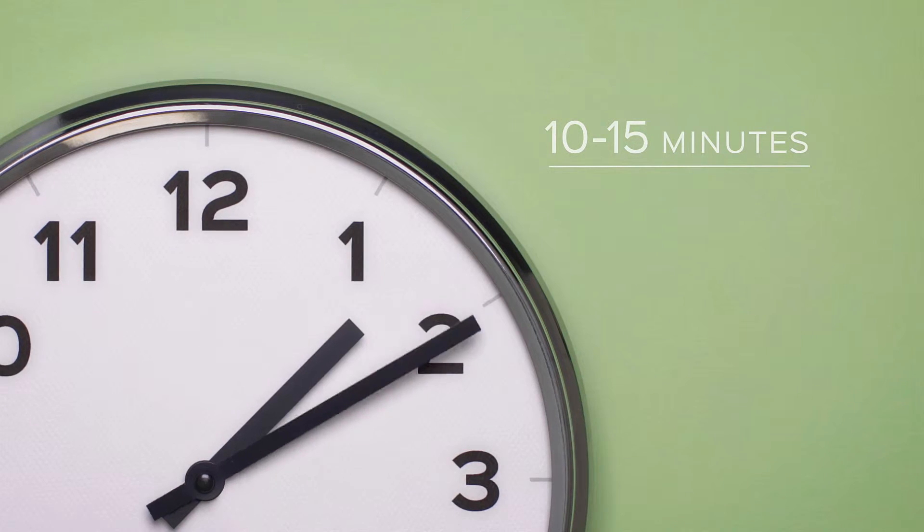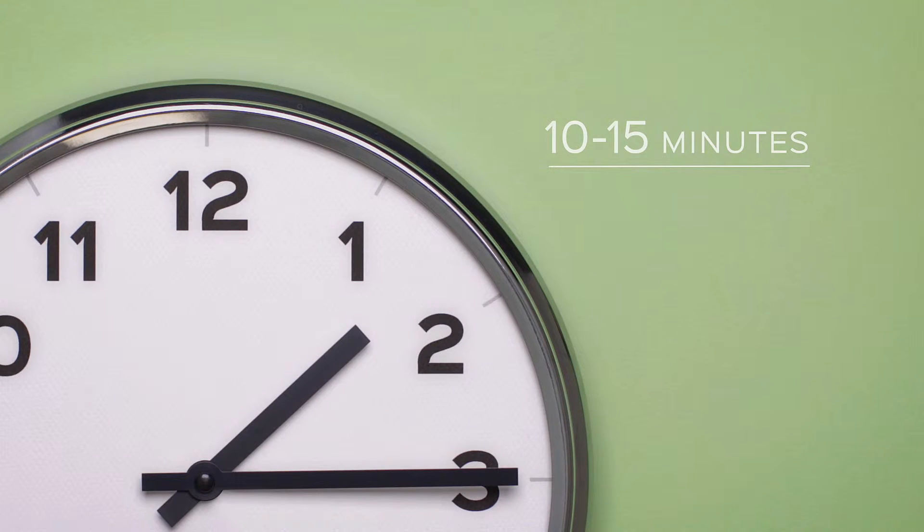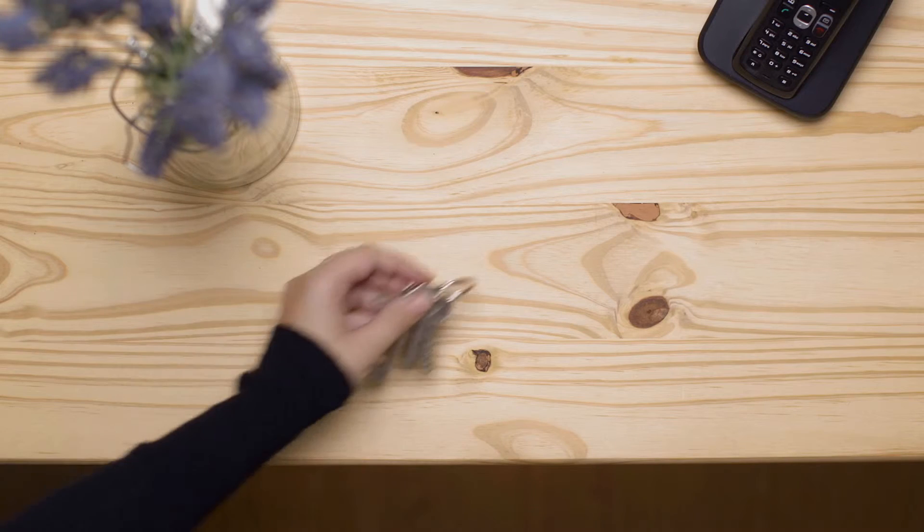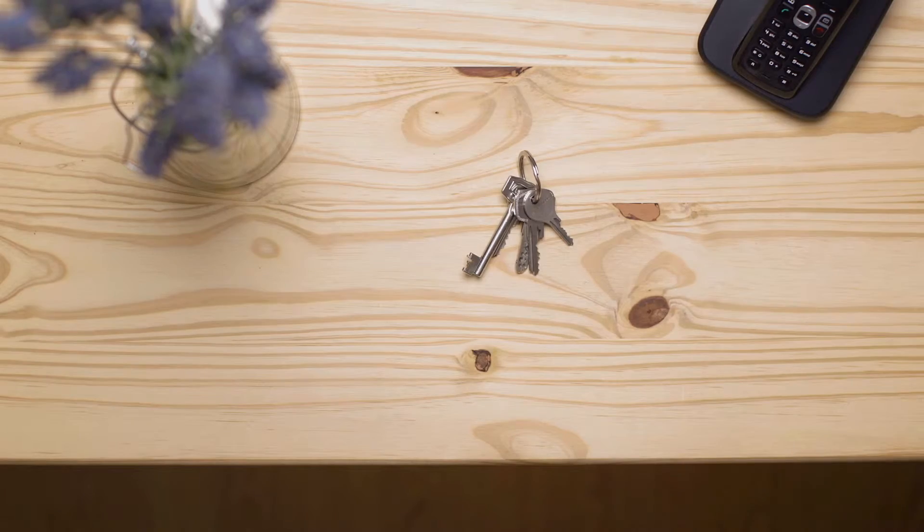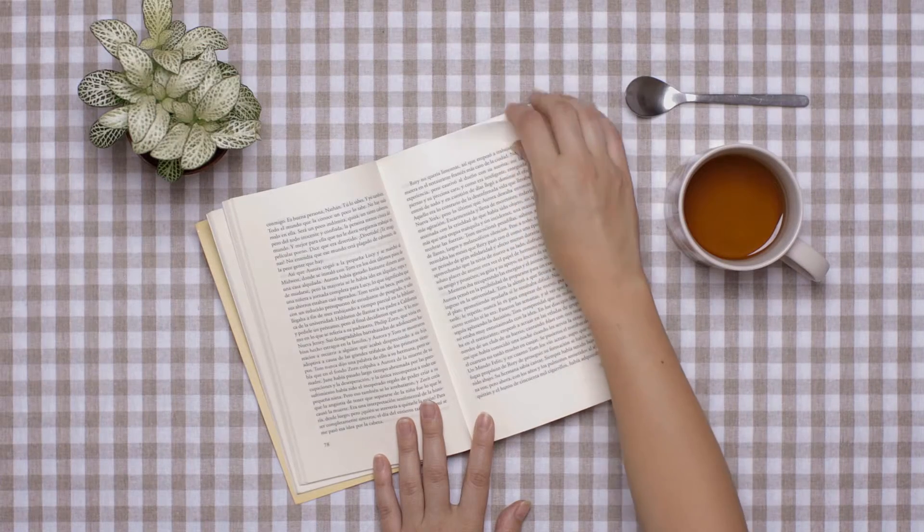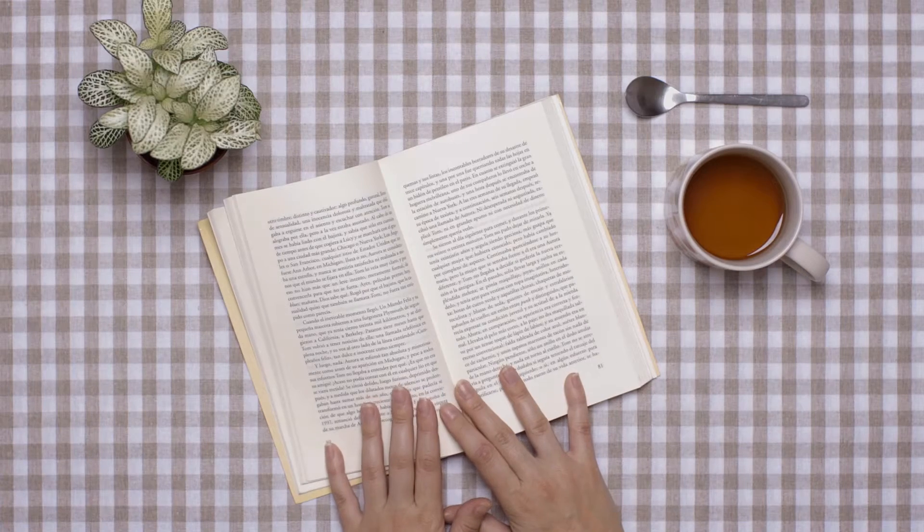This procedure takes between 10 and 15 minutes after which the patient will wake up normally. Two or three hours after the puncture the patient is released and can return home. She must take relative rest for the remainder of that day.